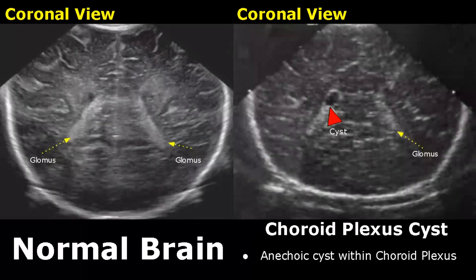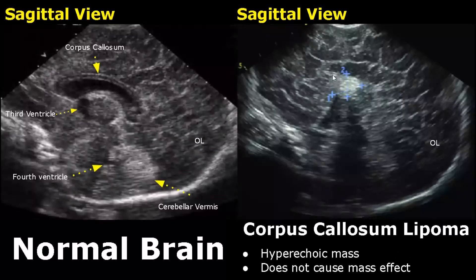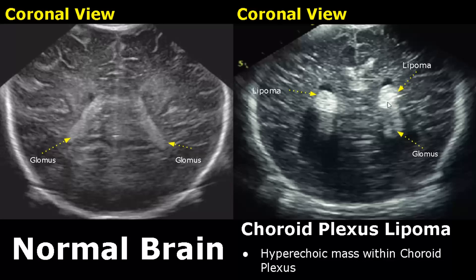A choroid plexus cyst will appear as an anechoic fluid collection inside the choroid plexus. A corpus callosum lipoma will appear as a hyperechoic mass at the interhemispheric fissure — this mass usually does not cause mass effect. Similarly, a choroid plexus lipoma may also occur, appearing as a hyperechoic mass at the choroid plexus.